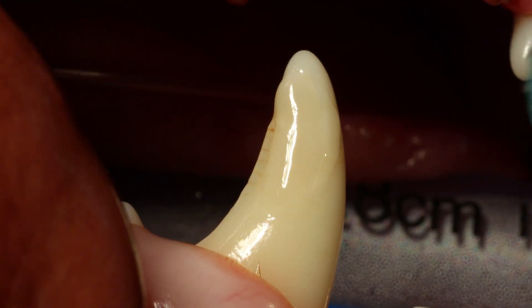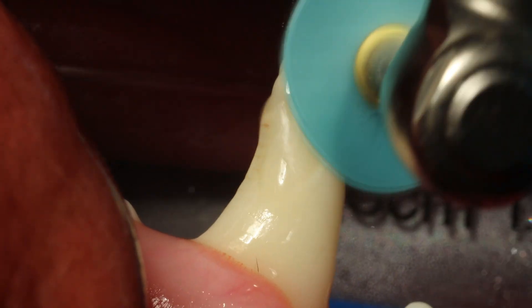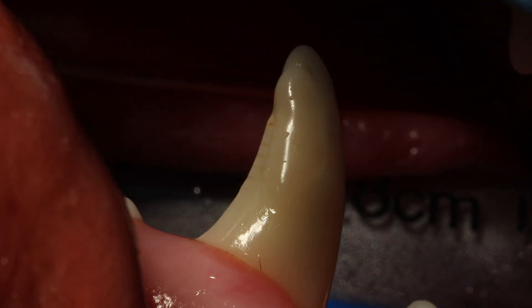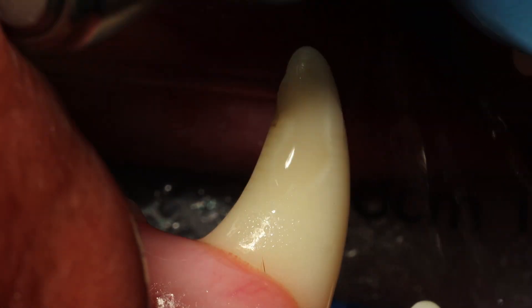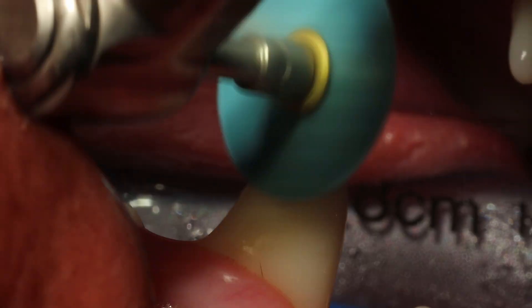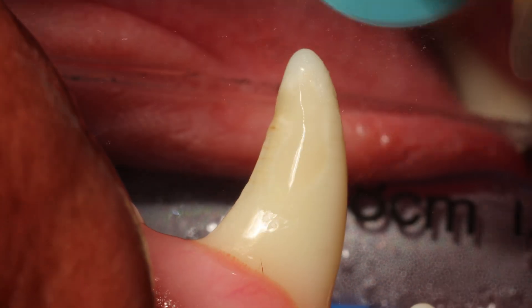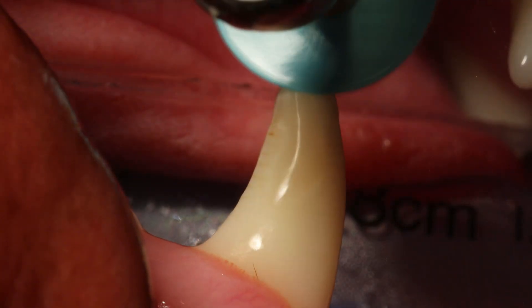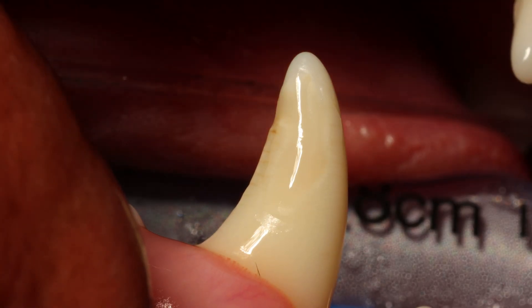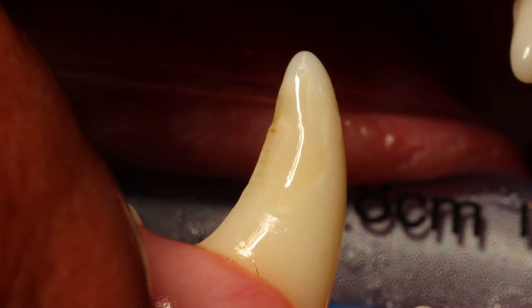The next part is you have to smooth. I intentionally put too much composite on — I don't try to align with the tooth surface when I apply it. I put too much on and then sand it down with sanding discs. I like the discs on canine teeth because they adapt to the surface pretty well and are very effective at reducing any edges.